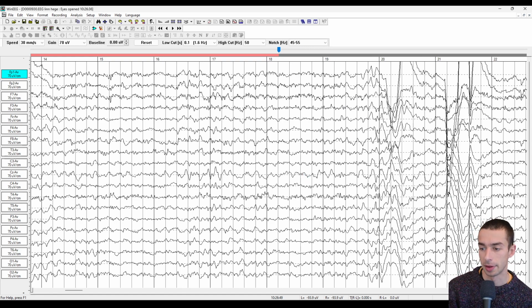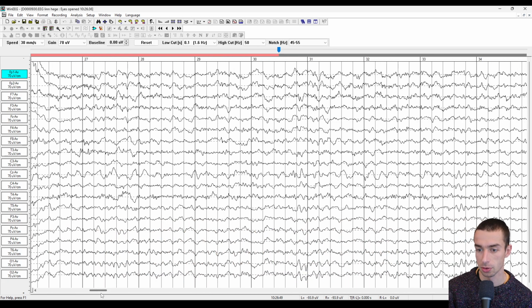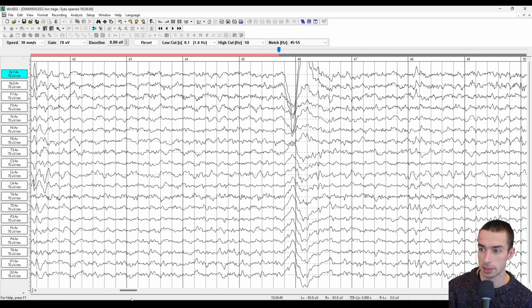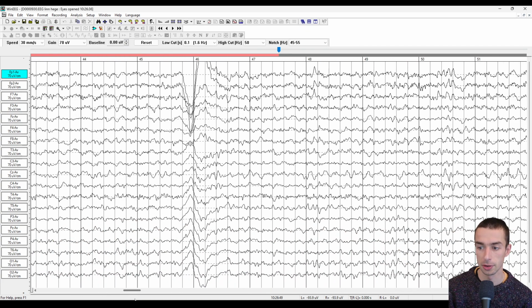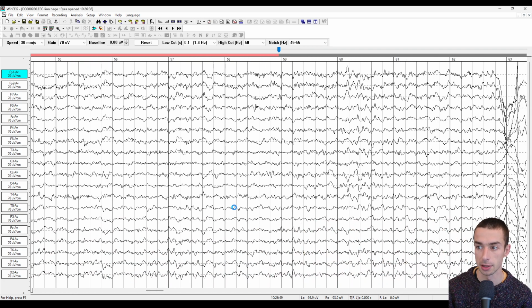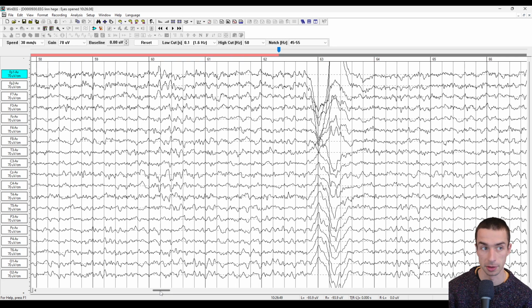And you can see we have eye blink here. So I'm just going to briefly scroll through, not get into any sort of clinical interpretation of the data, but just generally viewing what's happening in this file. It looks like it's not too long of a file. Here we are a minute in, and we're already basically almost a quarter of the way through the file here.